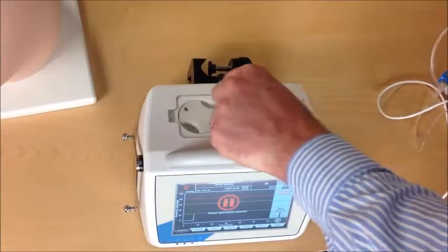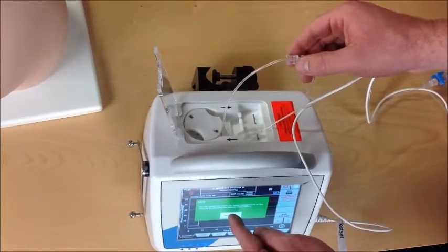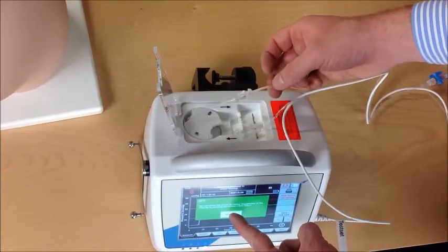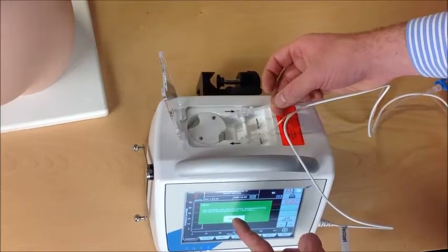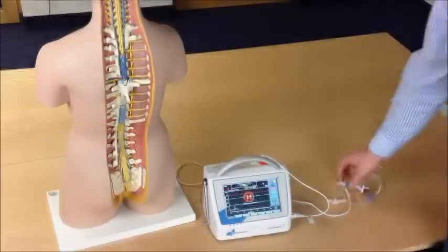Let's do the same in detail. Open the cover clap, insert the first connector, and press the button. Then insert the second connector and close the cover clap.